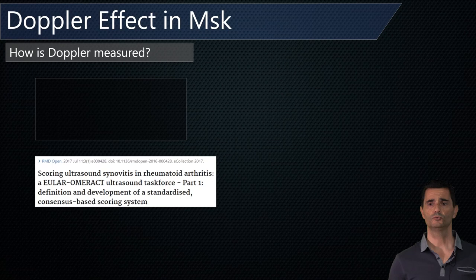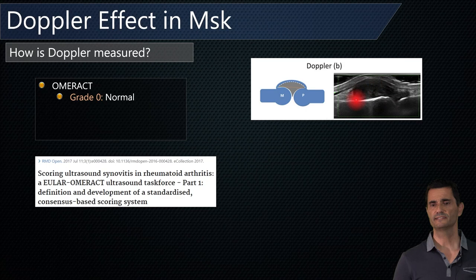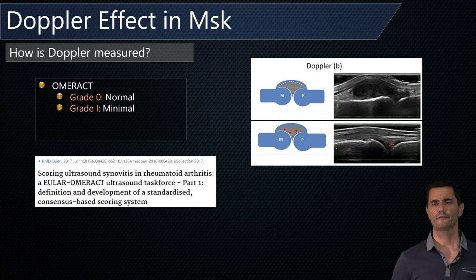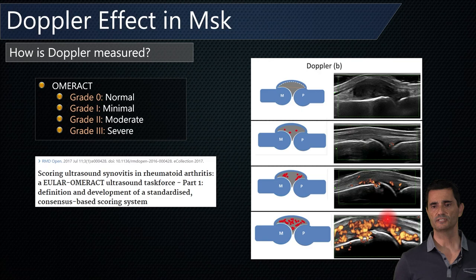How is Doppler measured? We follow the OMERACT recommendations. Grade 0 is normal — you can see the synovium, thick and hypoechoic, with no vessels inside and no vascularization. Grade 1 shows a few small vessels. Grade 2 is moderate vascularization, usually less than half of the synovium studied. Grade 3 is severe, when more than half of the synovium studied shows vascularization. So: 0 normal, 1 minimal, 2 moderate, 3 severe.